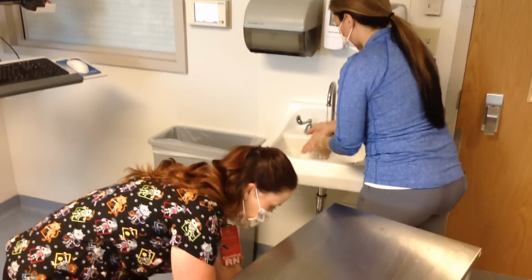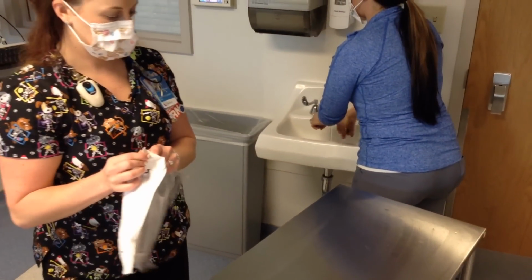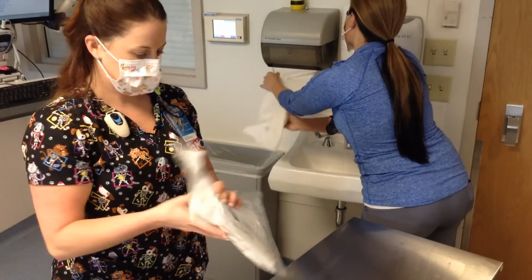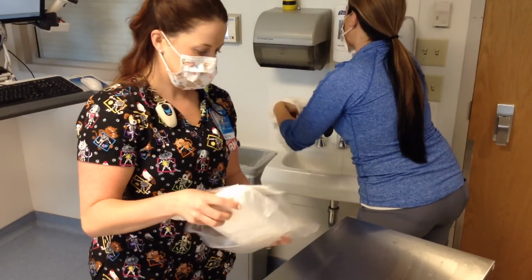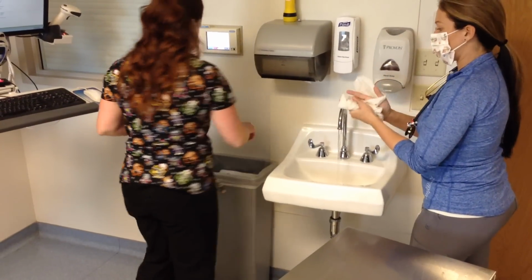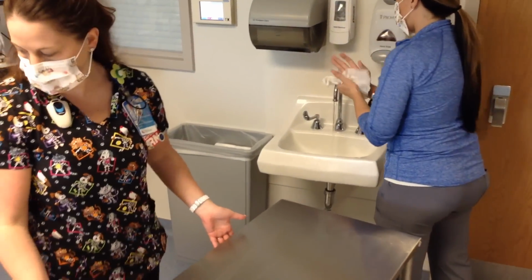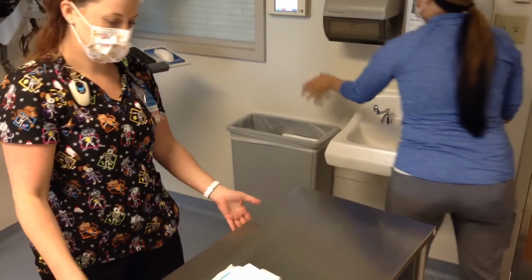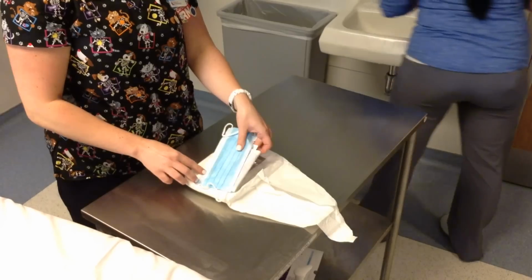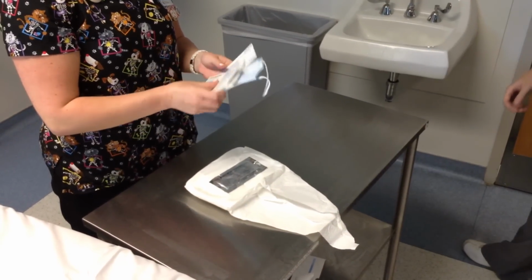Once our work surface is completely dry, then we will set up our sterile field. So you want to open the dressing kit and add additional supplies to the sterile field. Open the top flap away from your body. Place the sterile saline swabs, ChloraPrep sticks, and sterile gloves on a clean workspace.